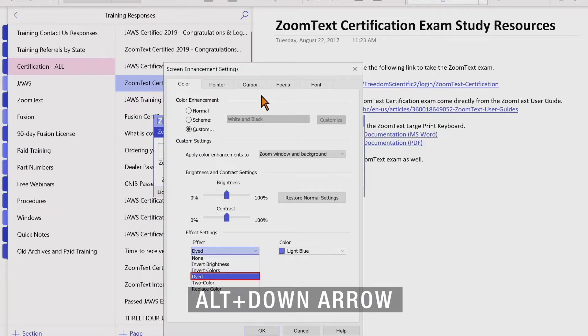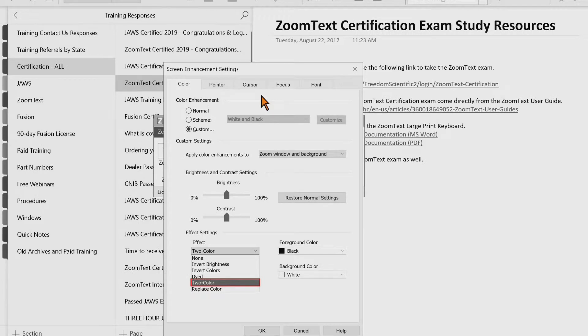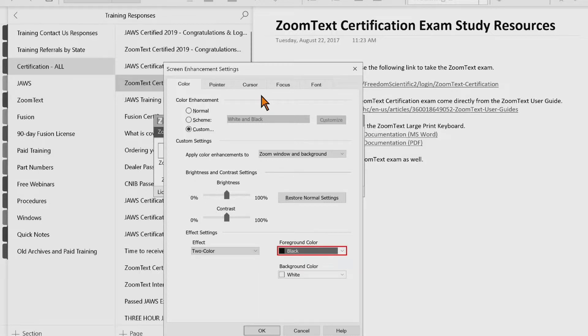The next option is Two Color, which transforms all screen colors to a two color spectrum. When the two color effect is selected, you have a choice between a foreground color combo box and a background color combo box — defaulting to black and white respectively.